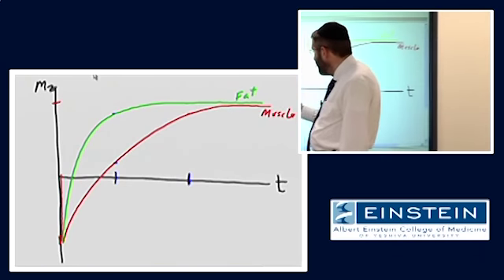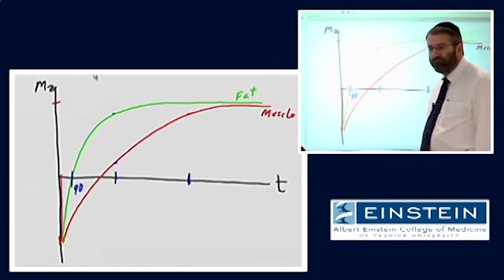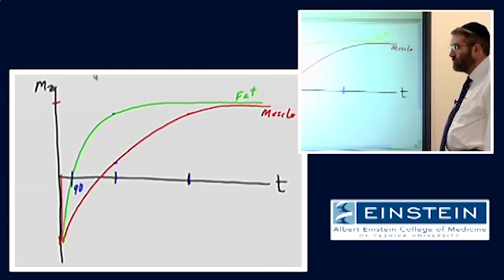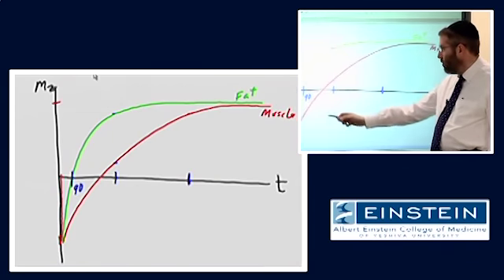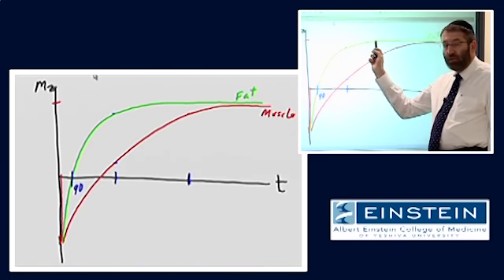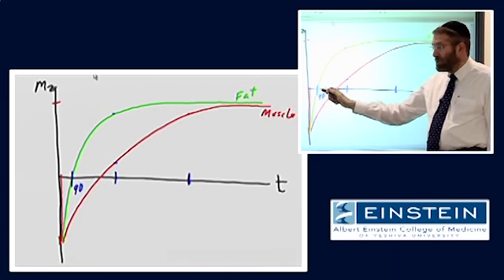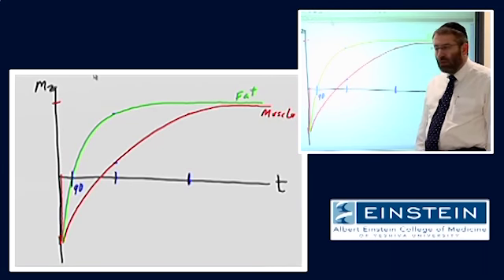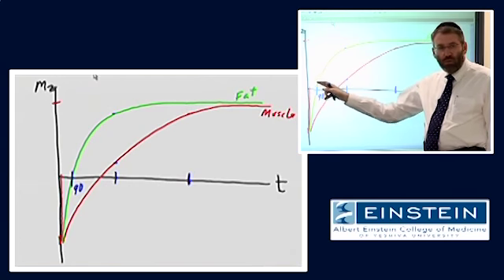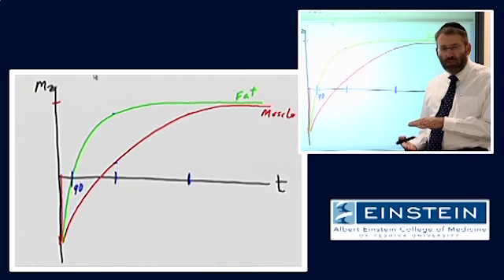What if I make my 90-degree RF pulse over here? Well, at this point in time, the curve describing the recovery of longitudinal magnetization from fat is crossing 0, which means there is no longitudinal magnetization present at that moment.